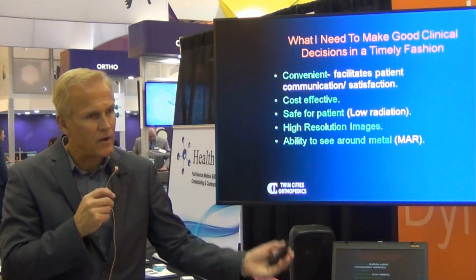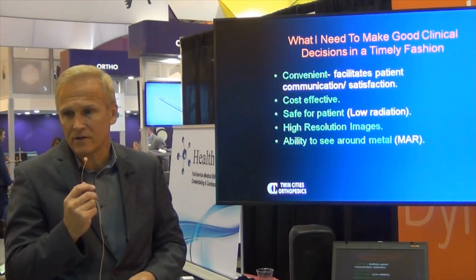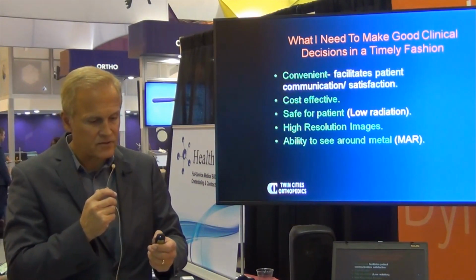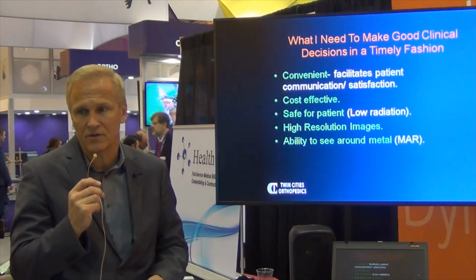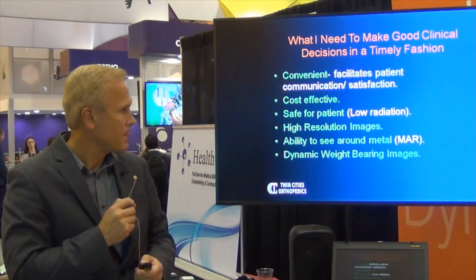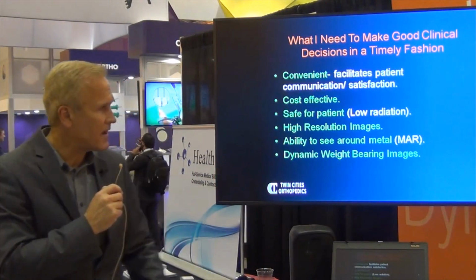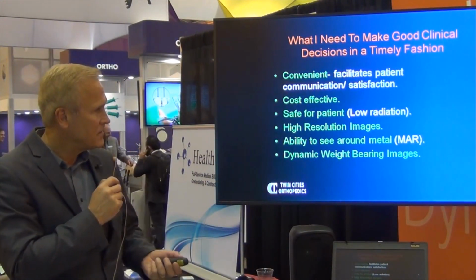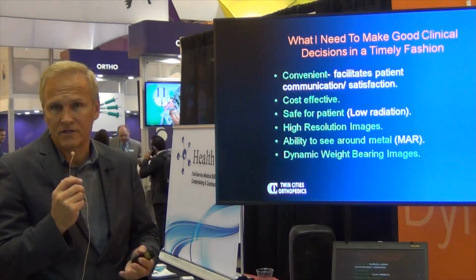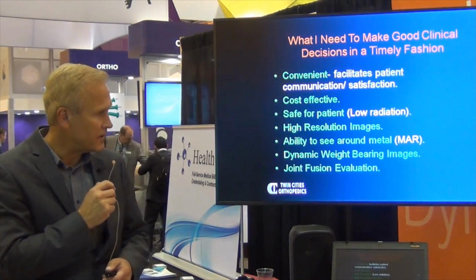I want to be able to see around that hardware, or if an implant like a total ankle is loose, I want to see whether or not the bone is attached to the metal. So the scatter from the typical CT scanner sometimes can obliterate some of that detail. And again, as I said before, the dynamic weight-bearing effect of the CT scan is very nice, evaluating the amount of cartilage loss in joints and also whether or not there's any ligament instability.